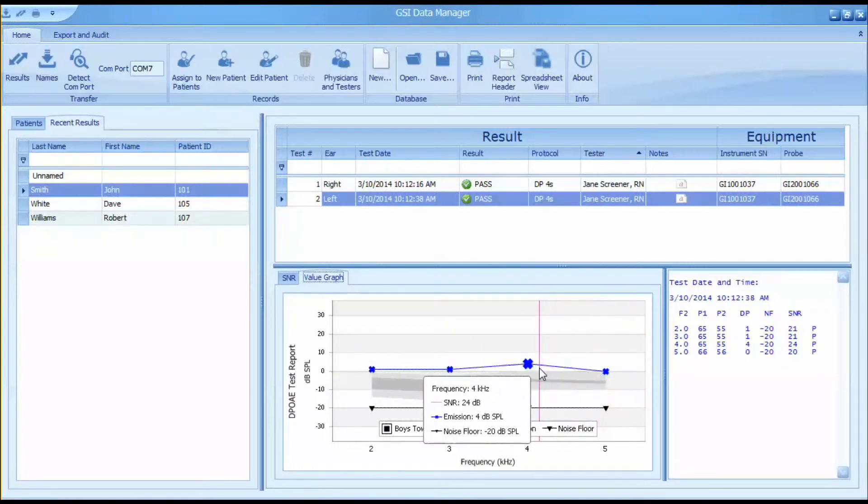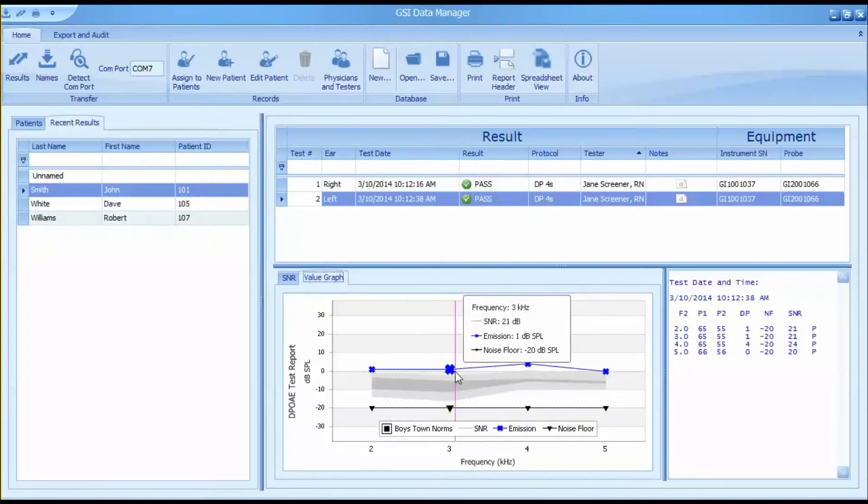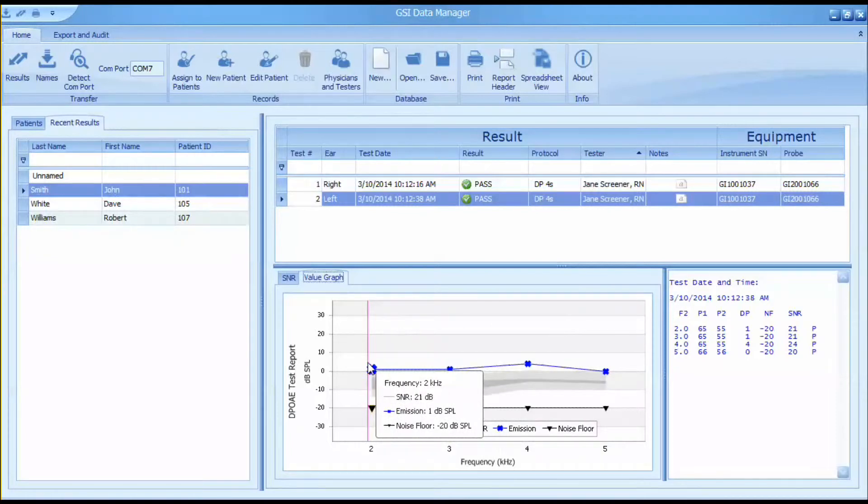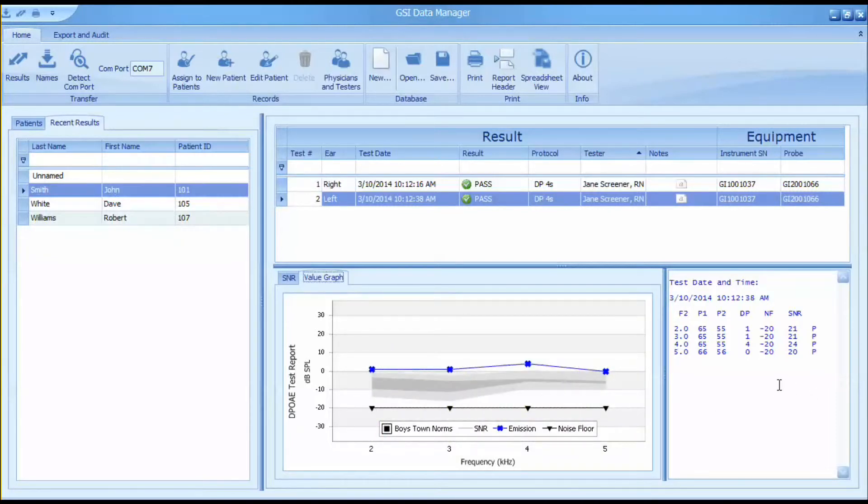The value graph is the DP or TE gram, which is a display of the OAE and the noise floor at each frequency in the test protocol.